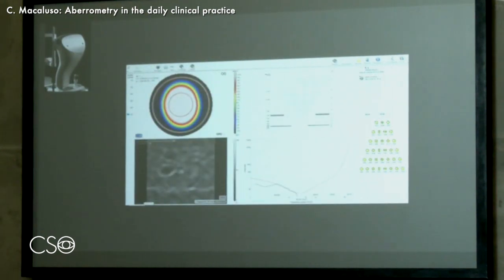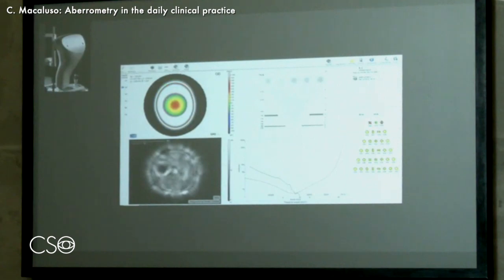We go to the same window we were in before, the visual effects of the aberrations, and this is something strange. On the left, we cannot really see the point spread function. The PSF is so big that it completely fills all the field. But if we switch to a smaller pupil, a 3 millimeter pupil, we start seeing something.